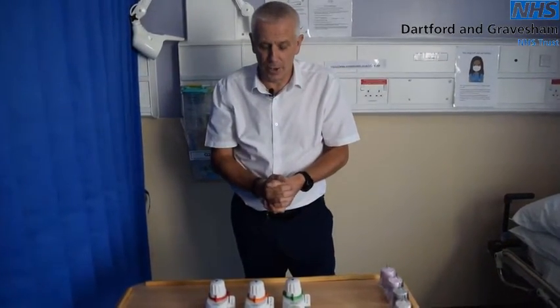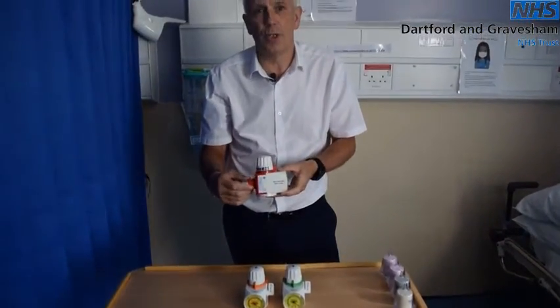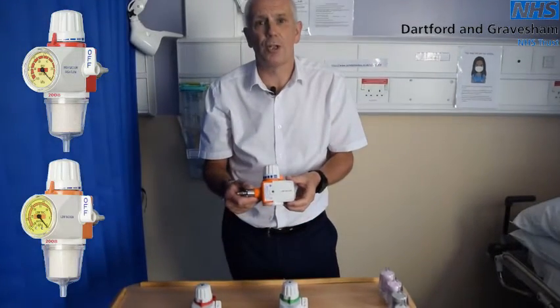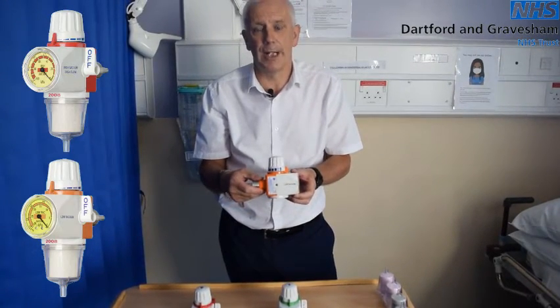Part two — suction — and we're looking at the different types of suction units. We have three different types. We have the red and white, which is a high suction unit found generally on most wards. We have the orange, which is the low suction, also known as low vacuum. This would tend to be found on paediatrics, A&E and ITU.